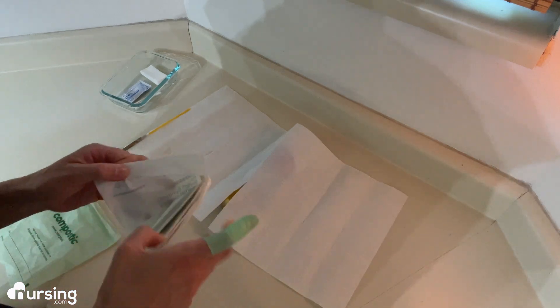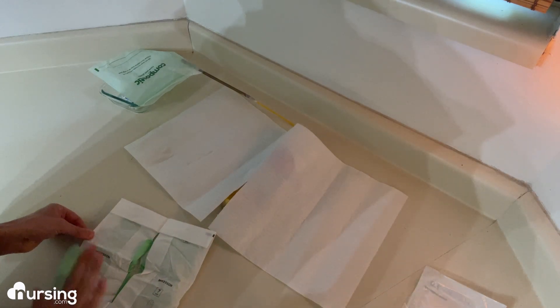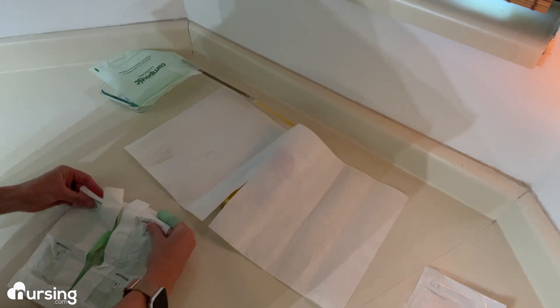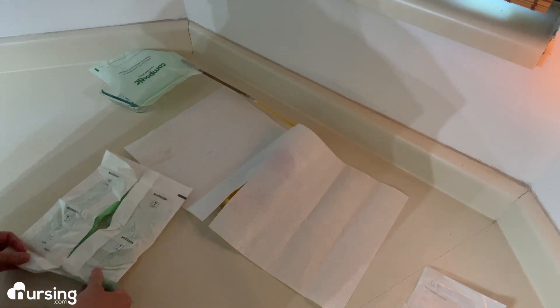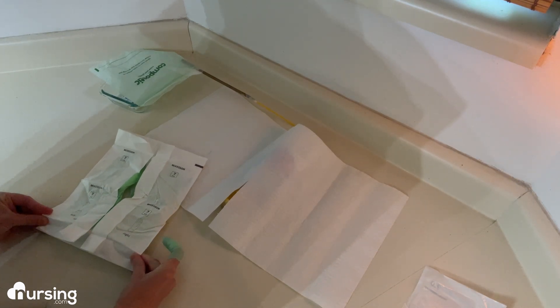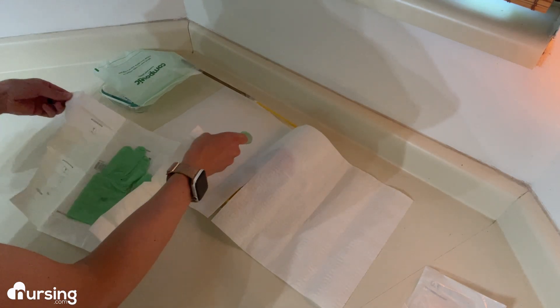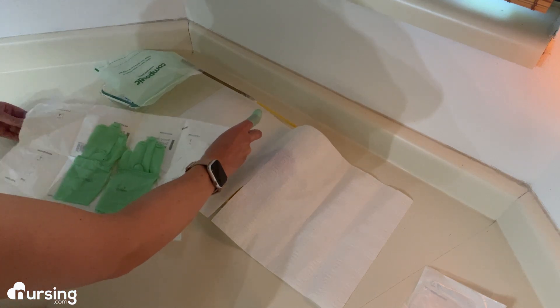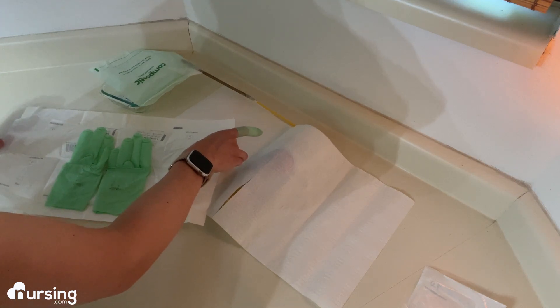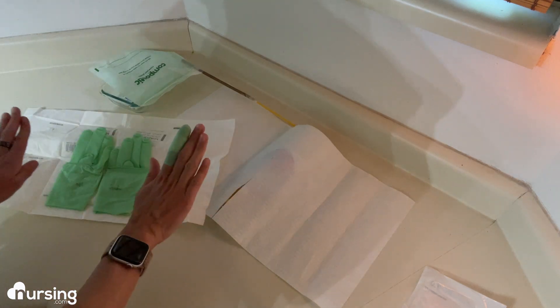With sterile gloves, you're going to open up the packet and then open up your gloves. Now inside the packet is all sterile, and I want that to stay sterile because inside the packet can be a sterile field. Make sure that all of these little bits are out of your way so that you're not potentially contaminating, then grab underneath those corners to open up and make sure the whole thing is opened up.